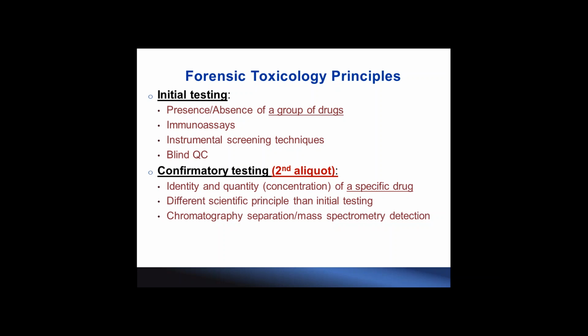I hope that would be a good example I give. I think out there they also have some instrumental screening technique that can screen all the drugs in just one run. In our lab, we don't do this.